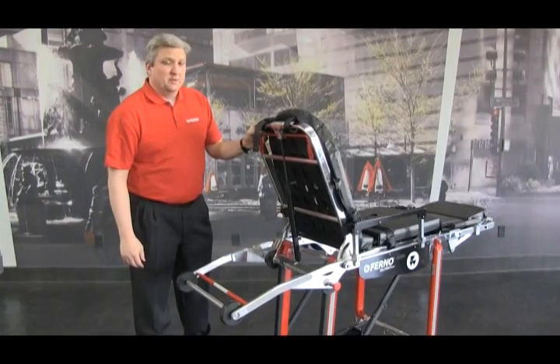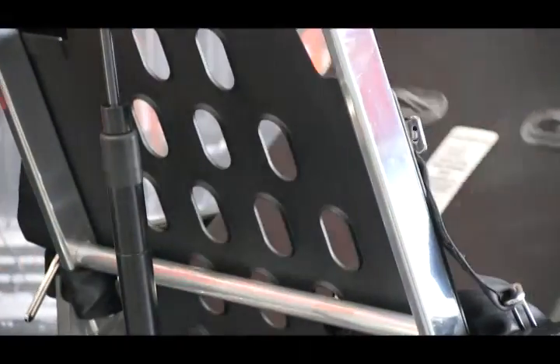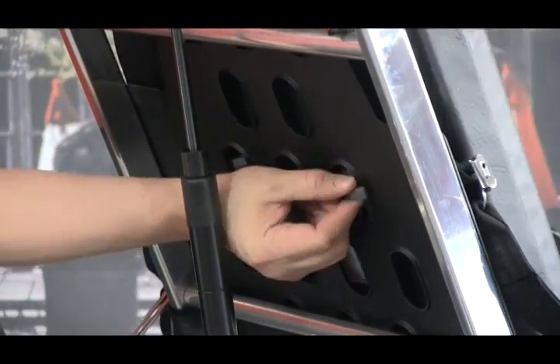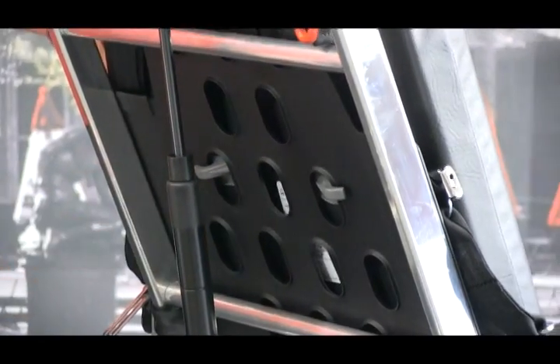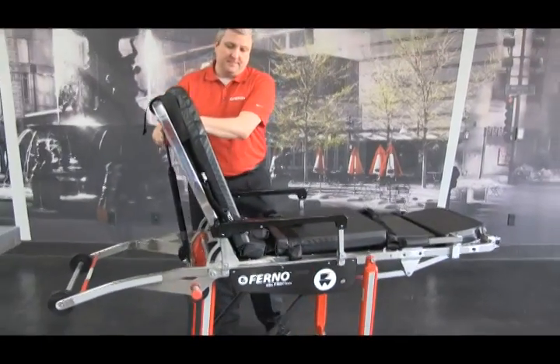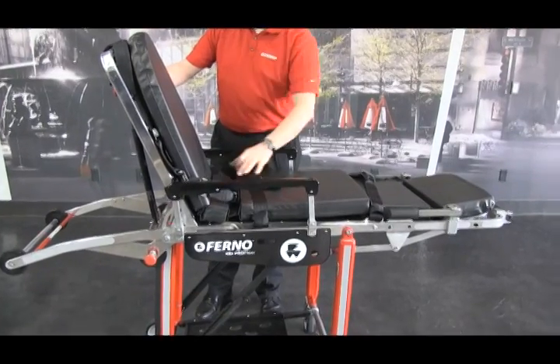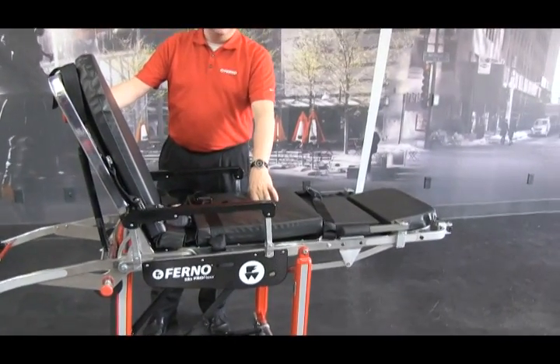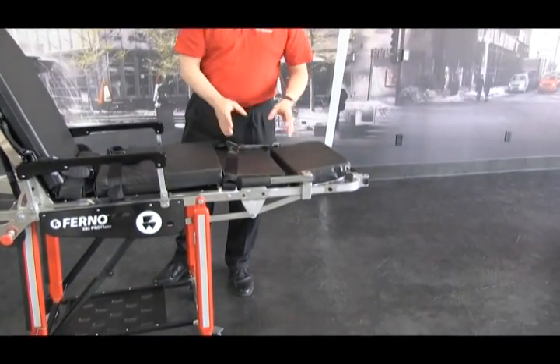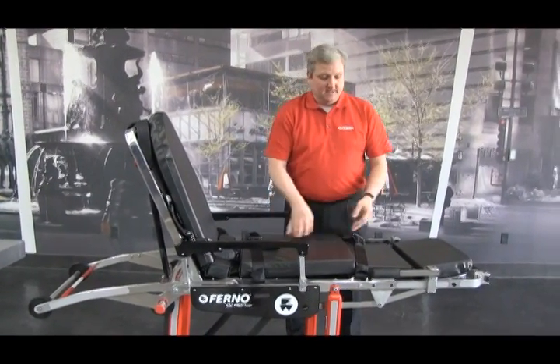The mattress can be removed by pushing the clips through the holes for cleaning purposes. To reattach it, put the clips back through the holes and lock them into place. The clips are located as follows: two clips in the backrest section, two clips in the seat section, two clips in the thigh section, and one clip each for the lower mattress. There are two separate mattresses for the 28Z — the backrest and thigh seats, and the legs.